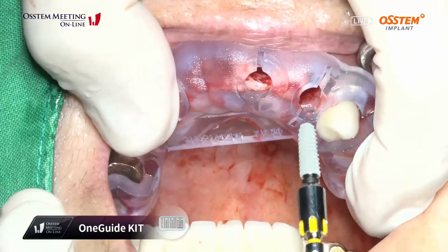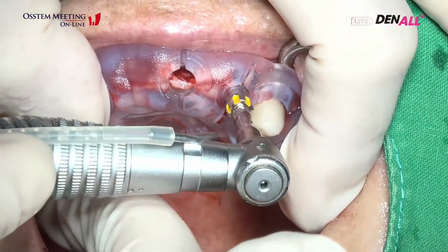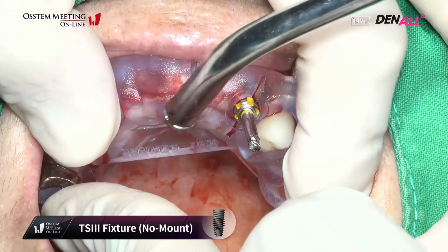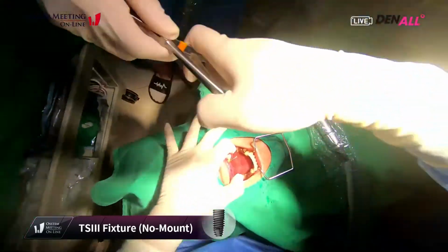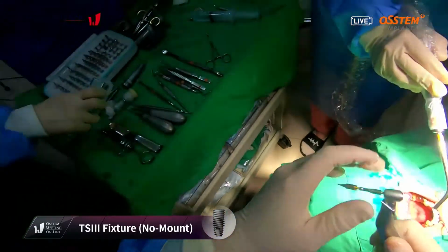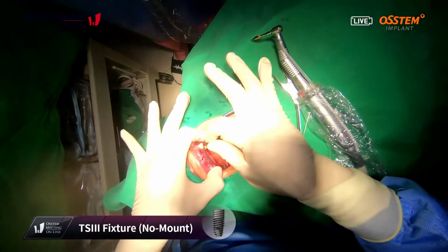This is 3.5 by 10. And then I will do depth control from the left side.